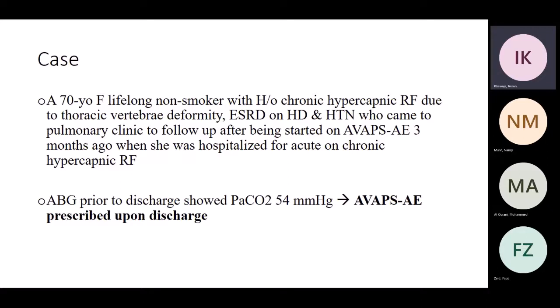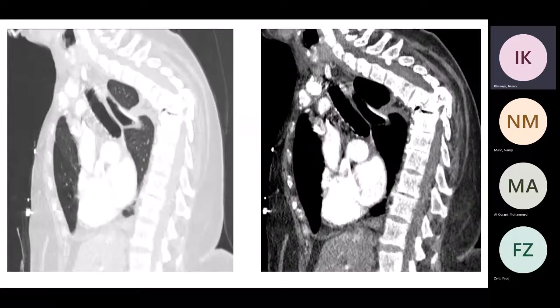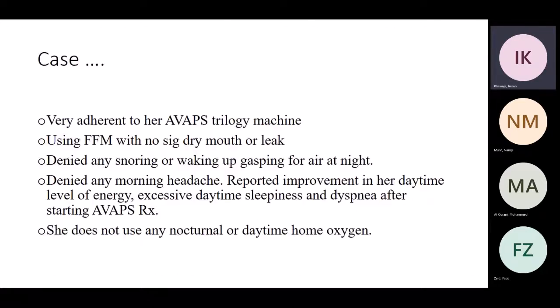So next, I'll show you the degree of the chest and vertebral column deformity, the kyphosis kind of picture. I think it's a mid-thoracic deformity, maybe T7 or T8. And by the way, this patient was labeled as COPD, if you don't know. Full inhalers, steroid. Has never smoked. And she's getting COPD treatment, and was called COPD.